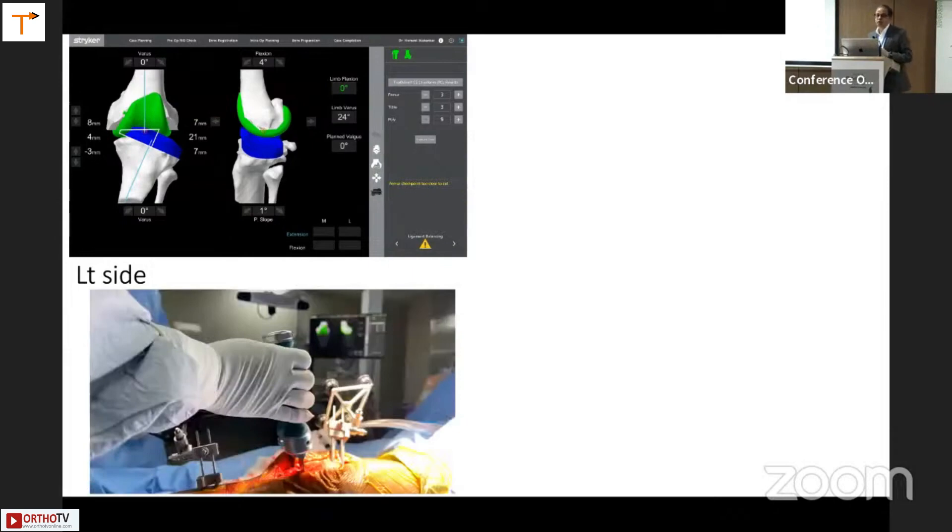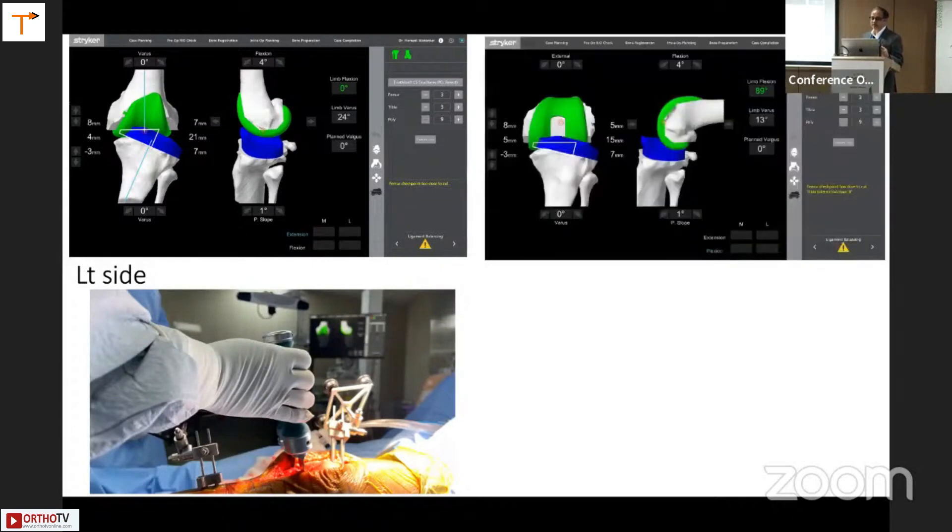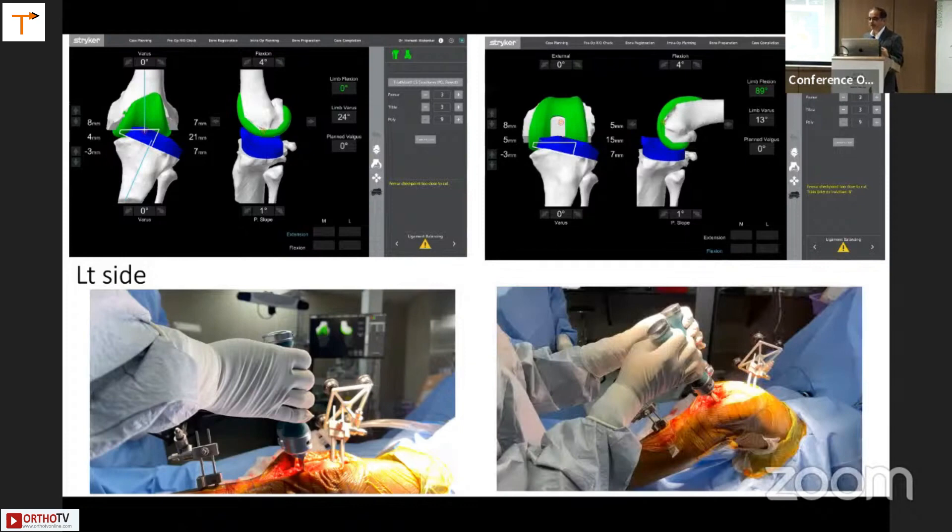What we do is put curved osteotomes in the joint space, both medial and laterally, distract manually, and then look at the screen to see what it shows us. That is the information registered on screen. The same thing is done in flexion — this is the screen at 89 degrees of flexion. It is very tight, showing 15, because a subluxed knee tends to show a figure less than 18. We put the curved osteotomes in the joint line, distract the joint, and look at what figures it shows.